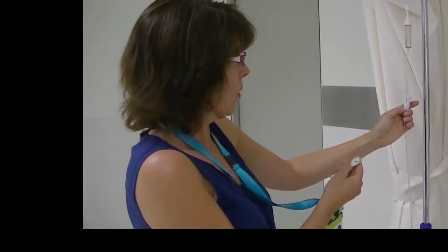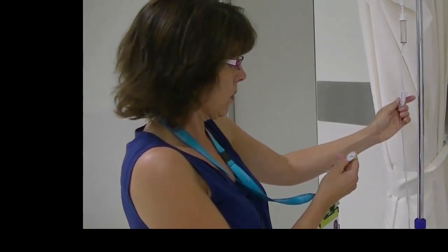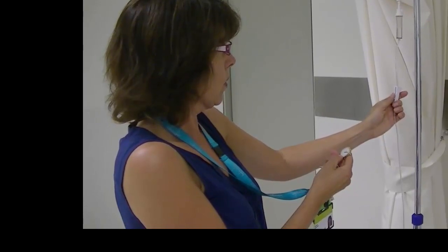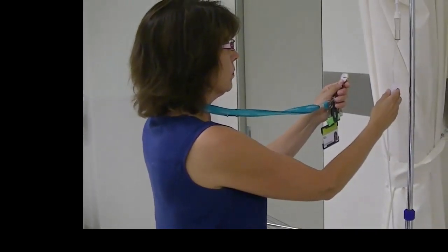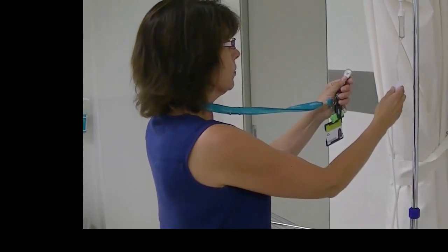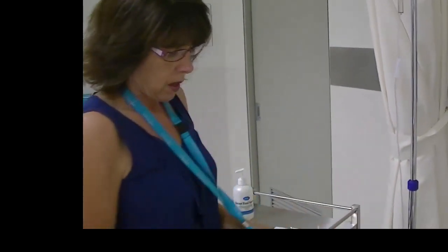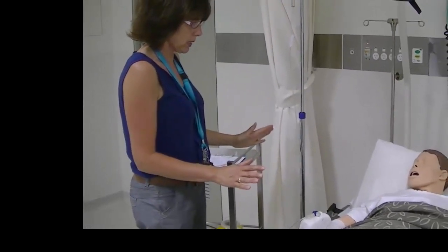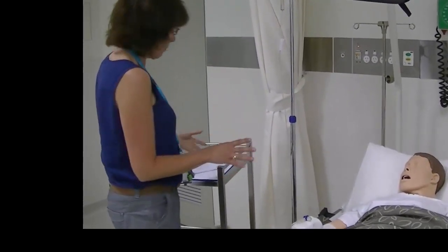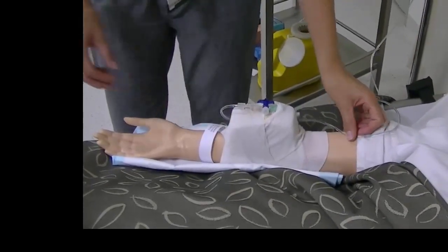Okay. So a little bit slower. There we go. So I counted it for 15 seconds. I can come back and count it for a full minute to make sure it is at the right rate. How are you feeling, Jessica? I will be back to check on you in 15 minutes. I'll just go and do my paperwork and tidy up. I'll also anchor the IV tubing further up the arm so there's no pulling on the actual cannula.